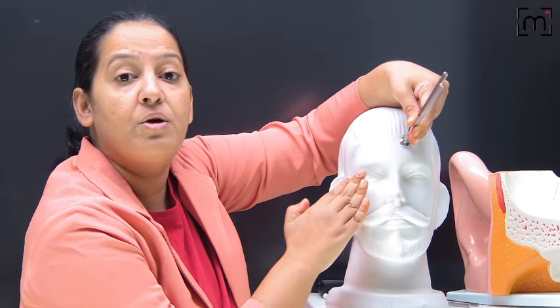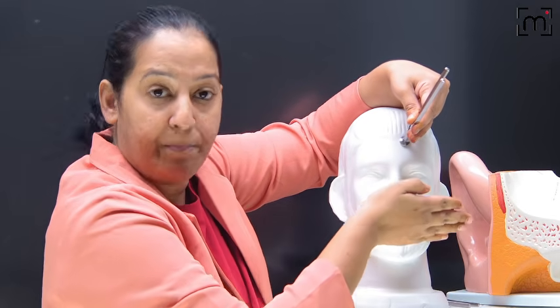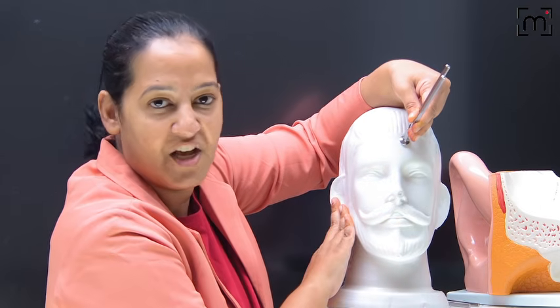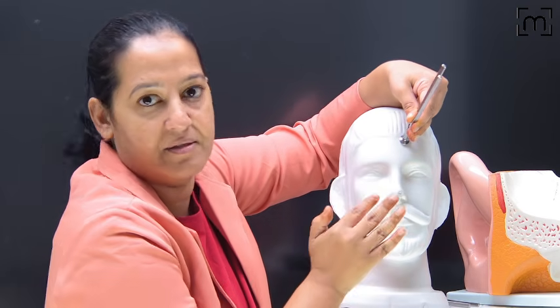So I will ask the patient in which ear you are hearing better. The patient says, I am hearing better in this ear, not in this ear. This is my diseased ear, ma'am. I'm not hearing better in this, I'm hearing better in this. Okay, good. Sensible. So this is sensorineural hearing loss.